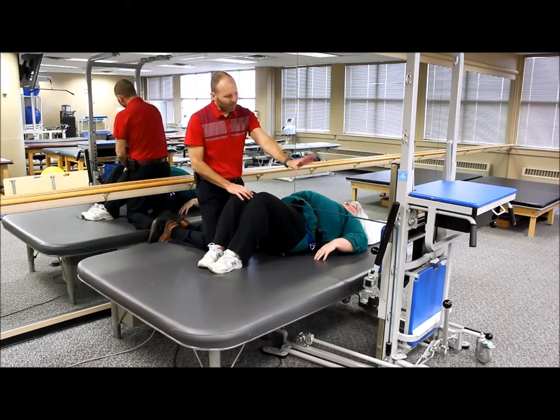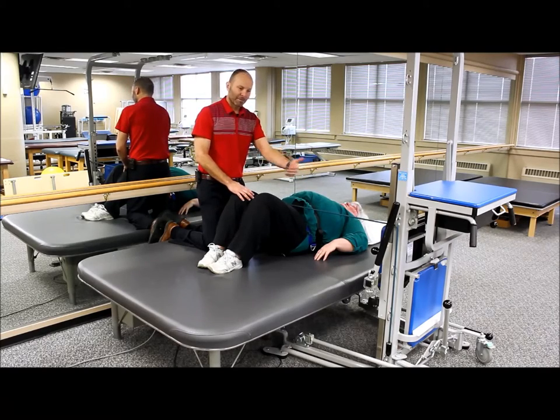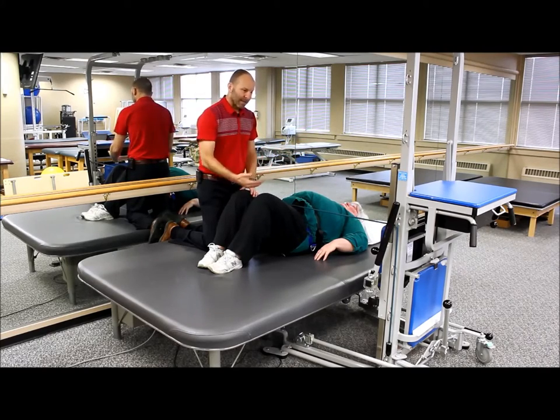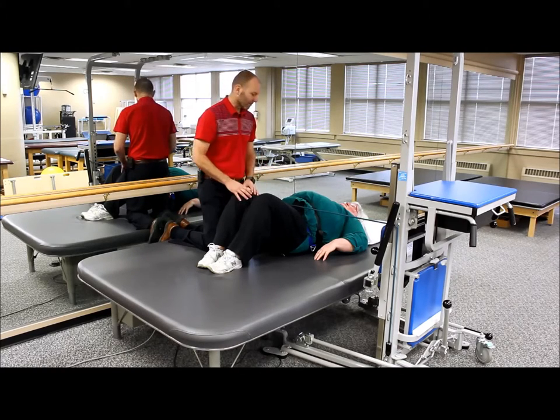The rehab station with the padding in place provides a nice safe place for her to practice rolling, so she doesn't feel like she's going to be falling off the edge of the bed. It also allows her to be more independent in practicing this rolling procedure.